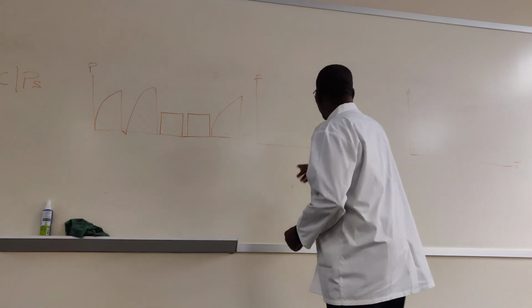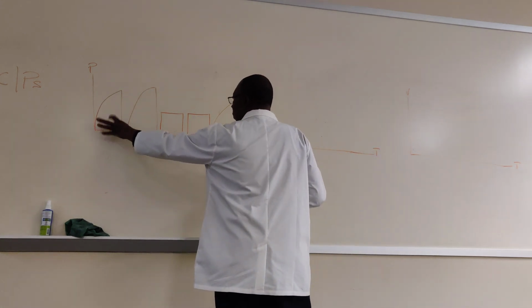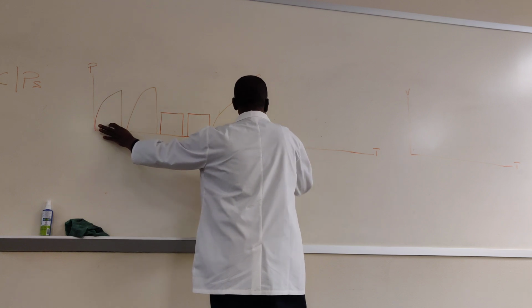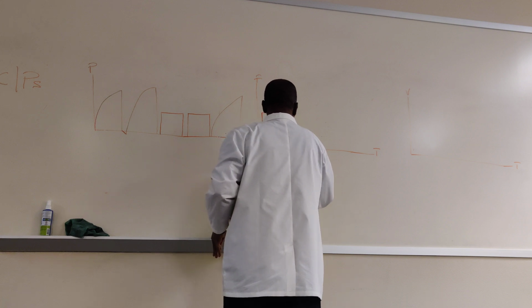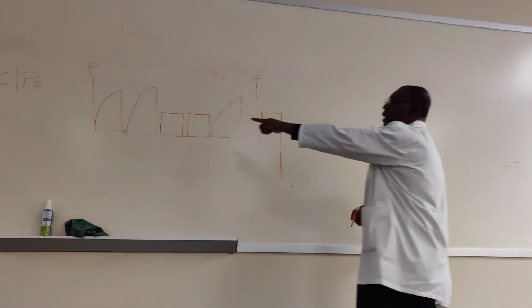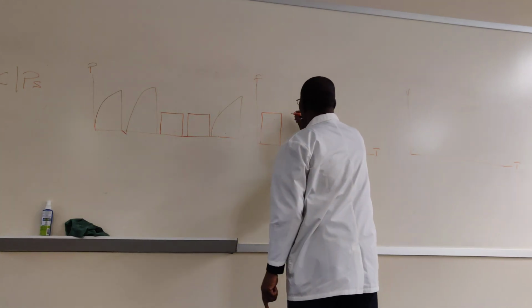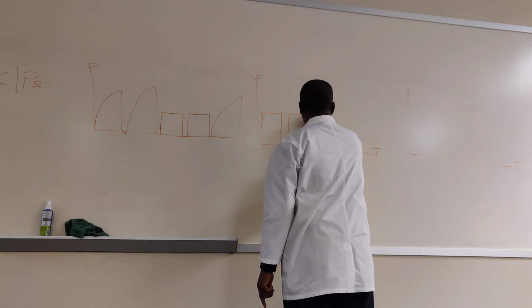So you come here to the flow, where this is a machine breath. We're guaranteeing tidal volume, therefore, the flow we have to guarantee as well. So it's going to look like this. Here's another machine breath. We are guaranteeing tidal volume, therefore the flow will be the same.